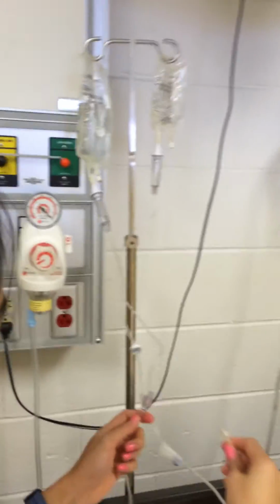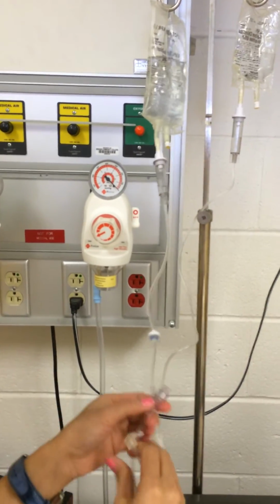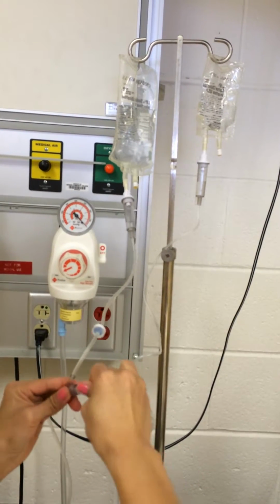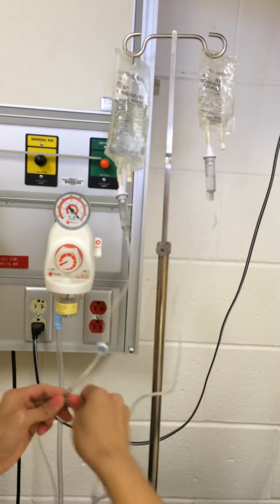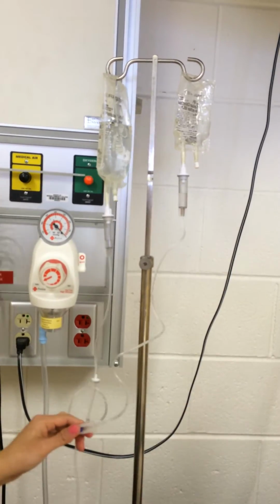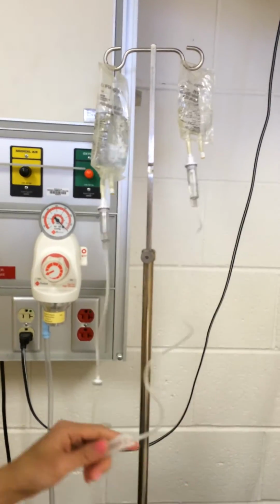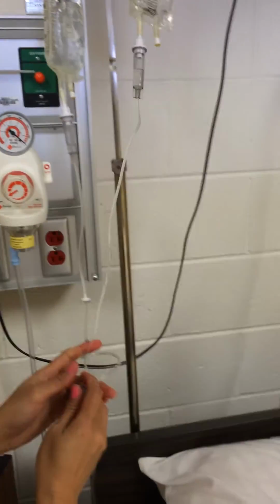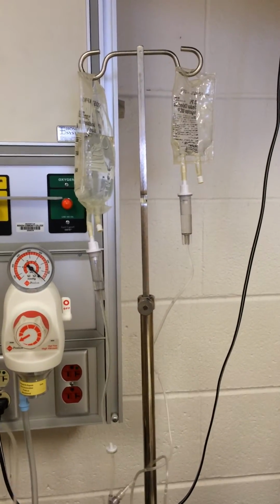Then I'm going to wipe it with alcohol. And I am going to attach it to the primary solution. After I connect it to the primary solution, I turn it on. I open it all the way up, and I recalibrate the drip rate again.